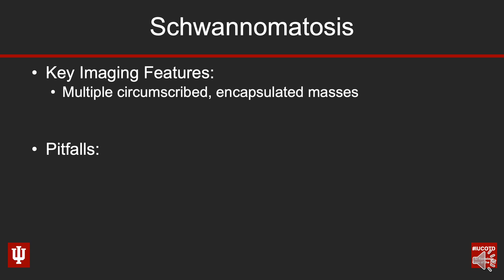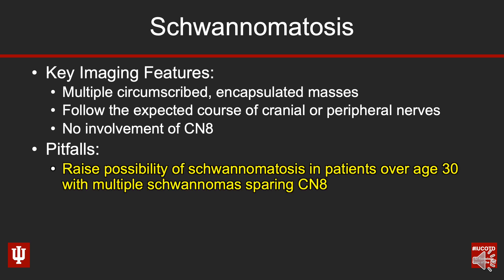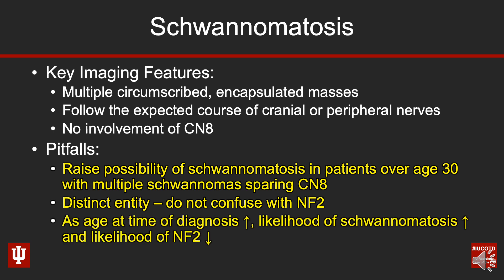To wrap up: our diagnosis here was schwannomatosis. The key imaging features to know — these patients will have multiple circumscribed, encapsulated masses that tend to follow the expected course of cranial or peripheral nerves. These schwannomas can occur literally anywhere in the body, so look for those typical locations of the major cranial nerves as a clue. Importantly, these patients cannot have vestibular schwannomas. A key pitfall is that this can be misdiagnosed as NF2 — keep schwannomatosis in mind particularly in patients older than 30 who have multiple schwannomas that spare the vestibular nerves.